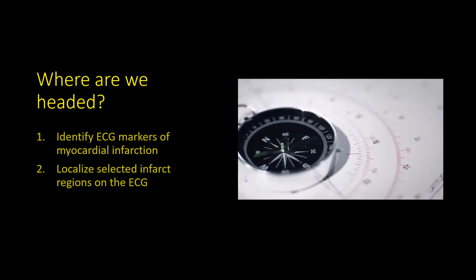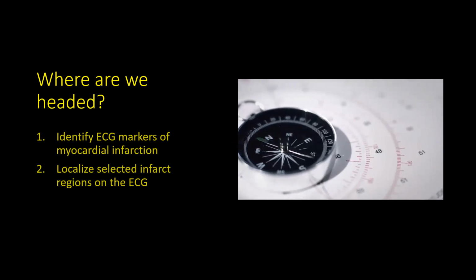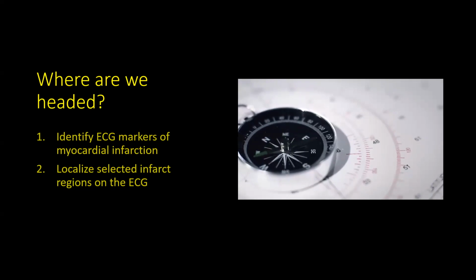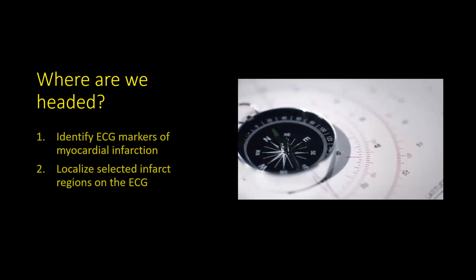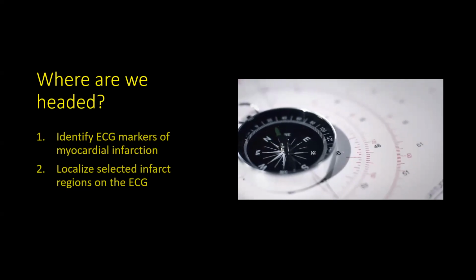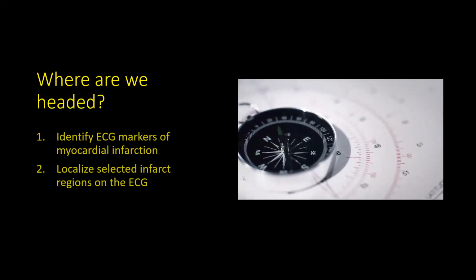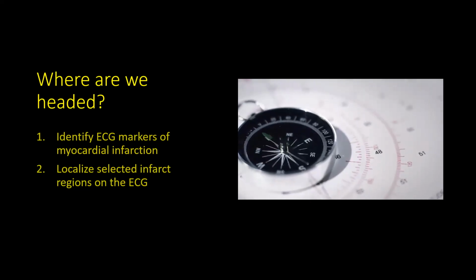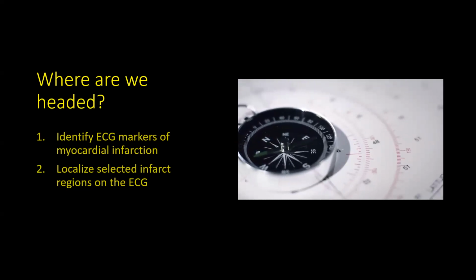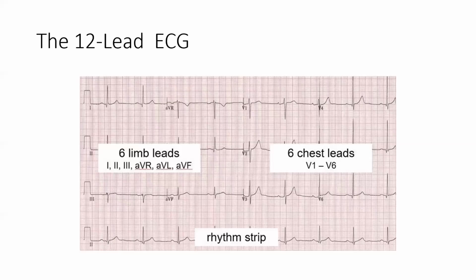Distinguishing patients with unstable angina from those with acute MI may be impossible during the initial presentation because their signs and ECG findings may be identical. Thus, it is necessary to have a combination of ECG findings, history, cardiac biomarkers, and other test results in order to confirm the diagnosis of myocardial infarction.